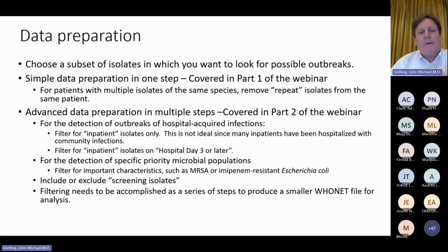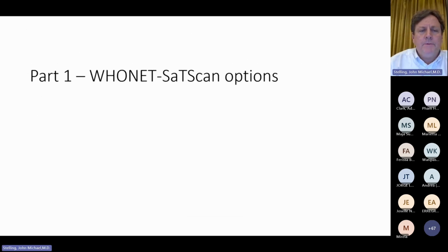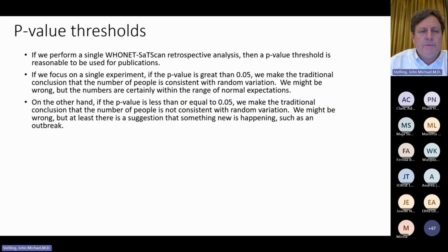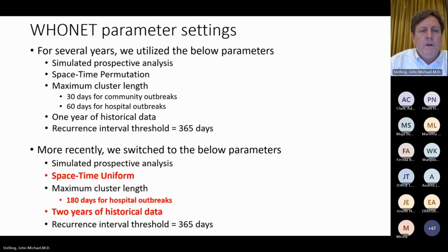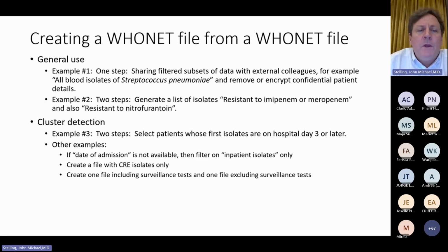Data preparation. Okay. So I already talked about this slide. I already skipped over this. Yes, this is where I am. So I'm going to do 3 examples. How can we take a WHONET file and make a smaller WHONET file out of it? Example number 1 has nothing to do with cluster detection.